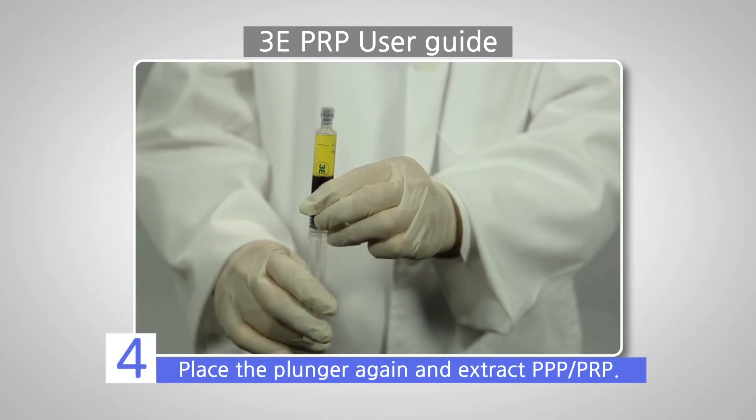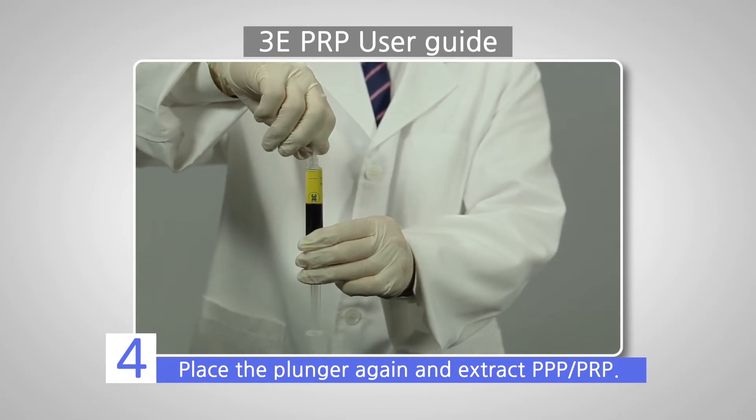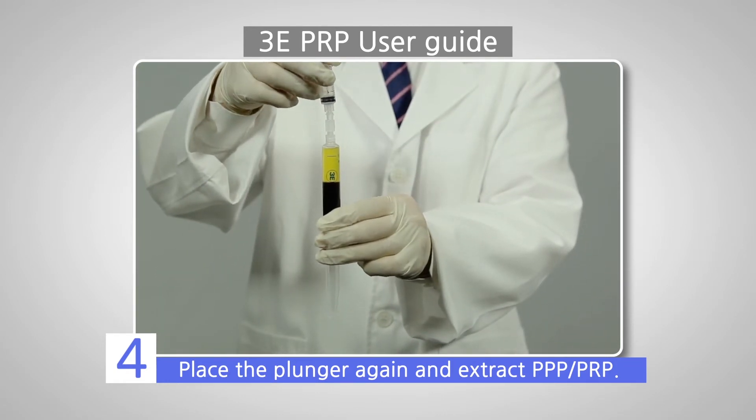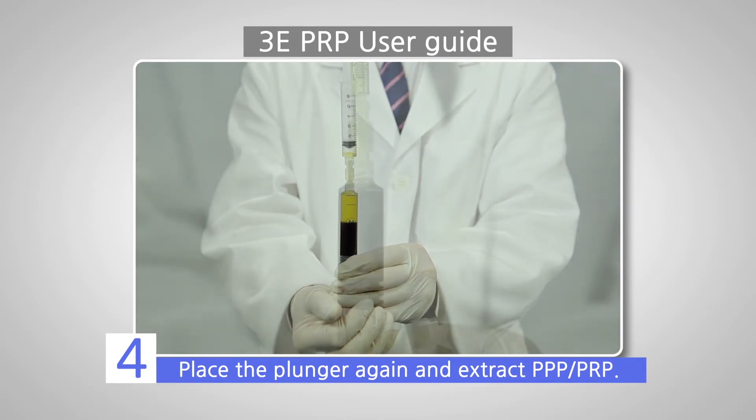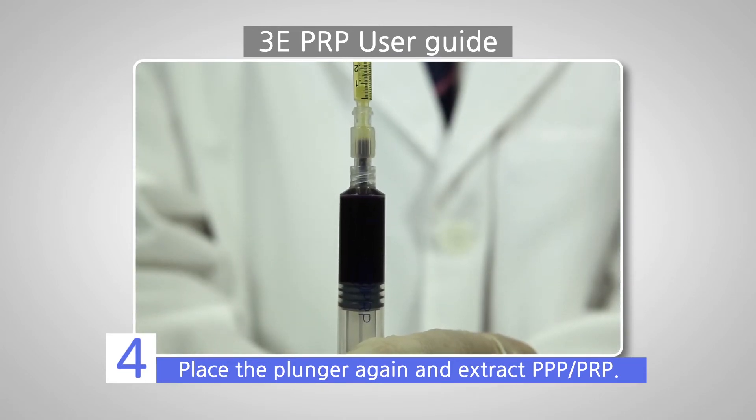Fourth, thread the plunger again and place the connector, 5 cc syringe, and 1 cc syringe in a row to extract PPP and PRP by pushing up the plunger.